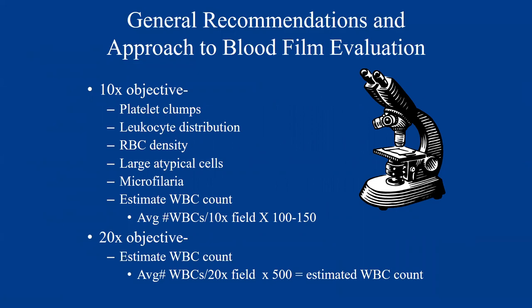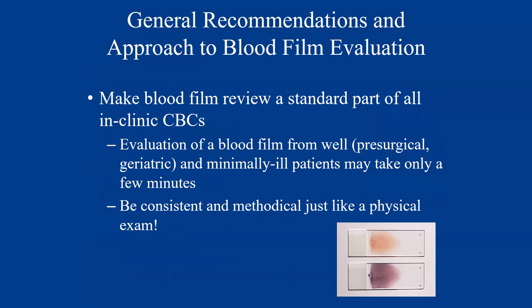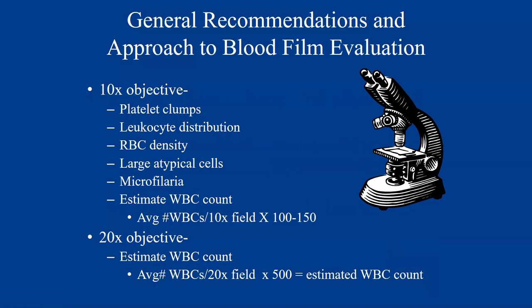When actually approaching the blood film, you want to make sure you do your evaluation in the monolayer, which is generally the area where about 50% of cells are about to touch but not overlapping. If you're at the feathered edge, you can get some disruption. If you go into the body, everything just clumps. There are still diagnostically relevant things to find at the feathered edge and body, but morphologic identification occurs in the monolayer of the slide.